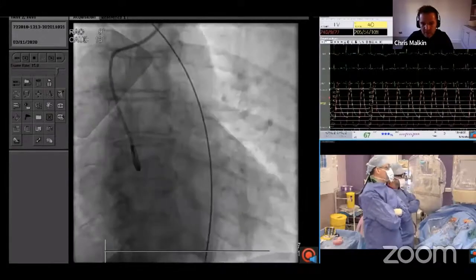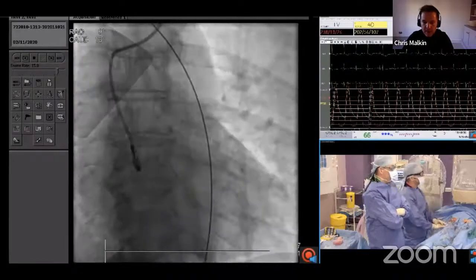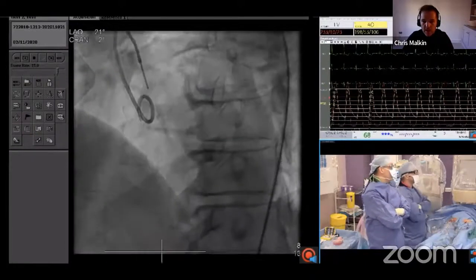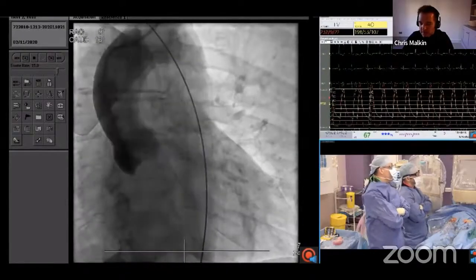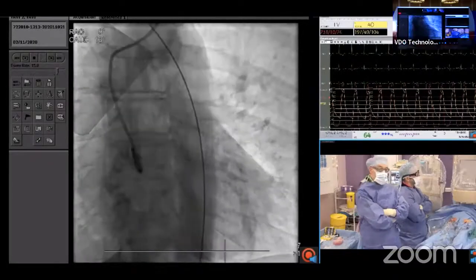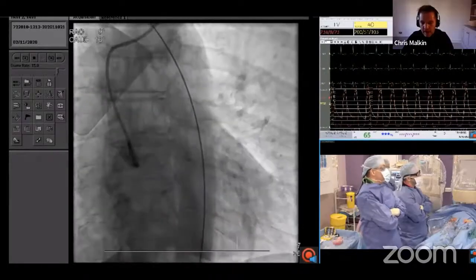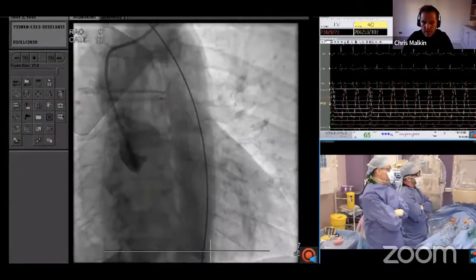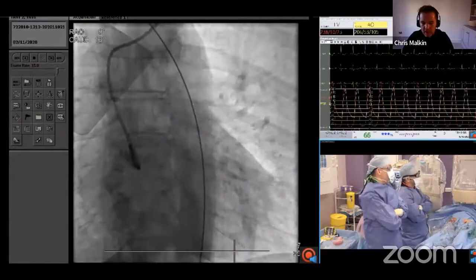Patient's awake, and you'll hear me talking to her later. I remember the patient very well. She was 78. She had some comorbidity. She was intermediate surgically risked, but had very good transfemoral options. And we elected to use a self-expanding device because she had very, very small anatomy with an annulus of around 18.5 millimeters. She had relatively light calcification on the valve, but she had a large septal bulge with an eccentric and even smaller LVOT.